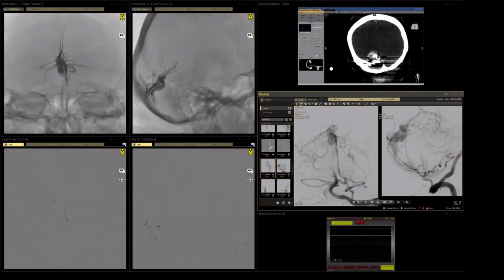Okay, I'm pulling the headway duo slowly. We know the characteristics of this catheter. Yes, that's kind of without high force. It's possible to retrieve.